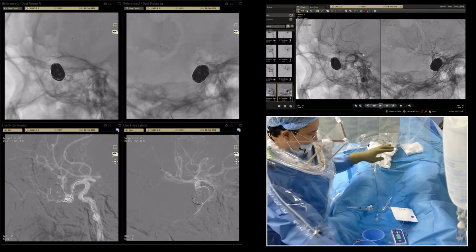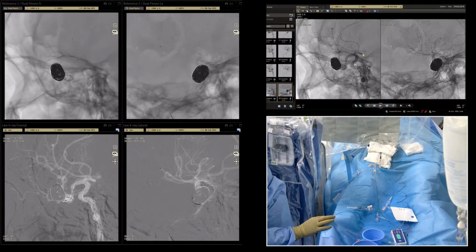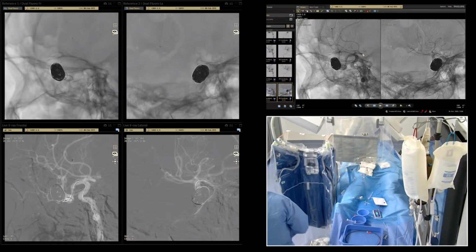There is a stenosis and narrowing. Now there is the option to open the 4 mm LVIS. The first one was 3.5. I think it was 3.